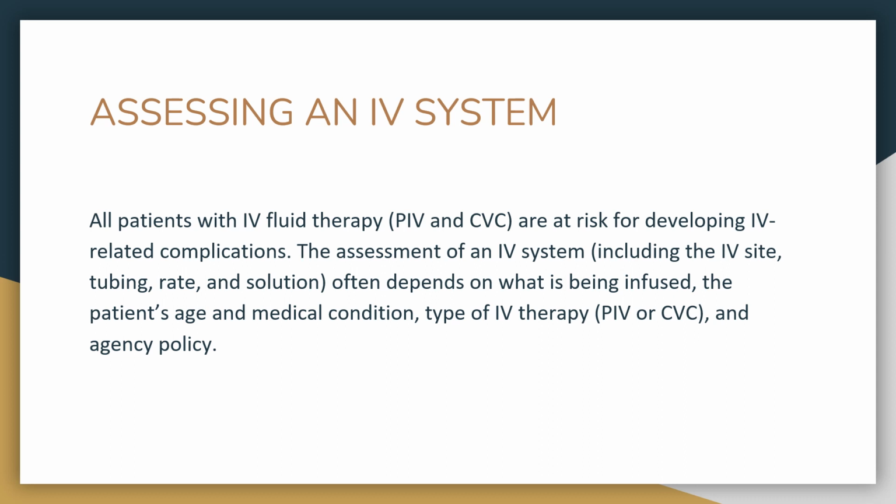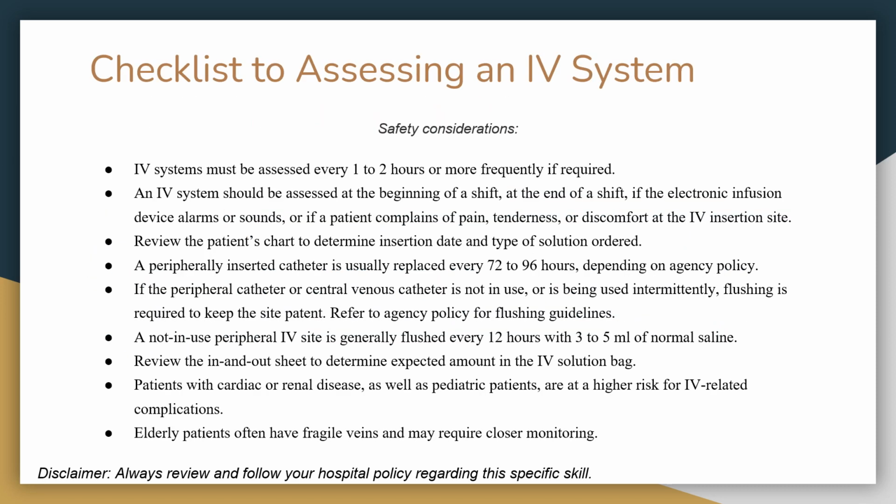Assessing an IV system. All patients with IV fluid therapy, whether it's peripheral or central, are at risk for developing IV-related complications. The assessment of an IV system, including the IV site, tubing, rate, and solution, often depends on what is being infused, the patient's age and medical condition, type of IV therapy, whether it's a PIV or a CVC, and agency policy. So there's a checklist typically used for assessing an IV system.